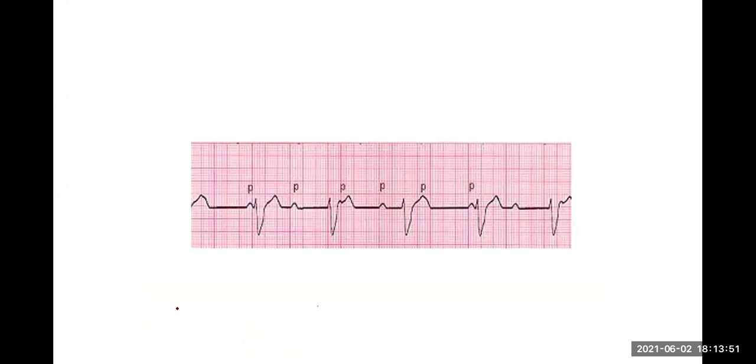Final one, third degree block. None of the P waves go. None of the P waves go.